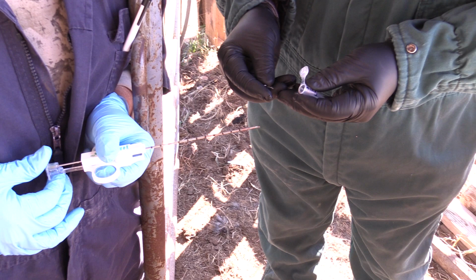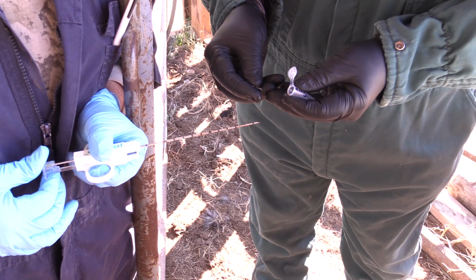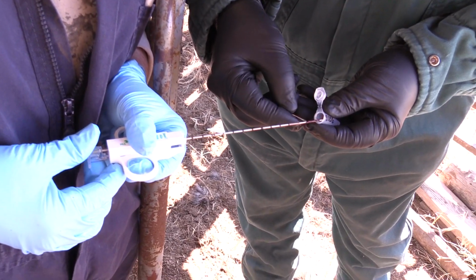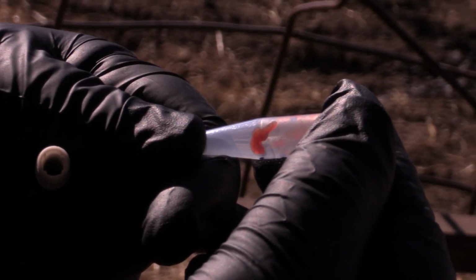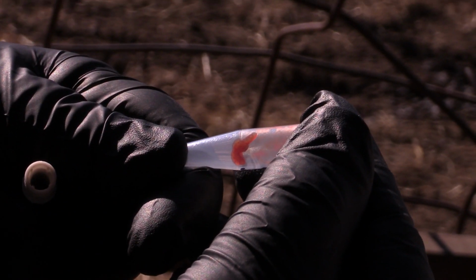Reveal the notch that contains the liver biopsy sample by pushing the spring-loaded handle forward. Remove the biopsy sample using a hypodermic needle and place it into a royal blue plastic falcon tube or conical snap cap tube. Remember, do not use a red top tube. Place the biopsy sample onto the side of the tube and let the sample dry in place. Do not add saline or fluid to the tube with the biopsy sample.